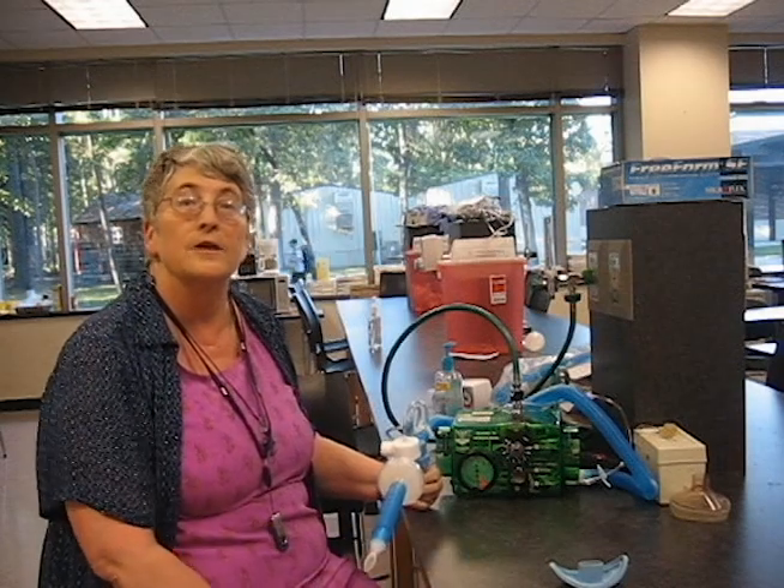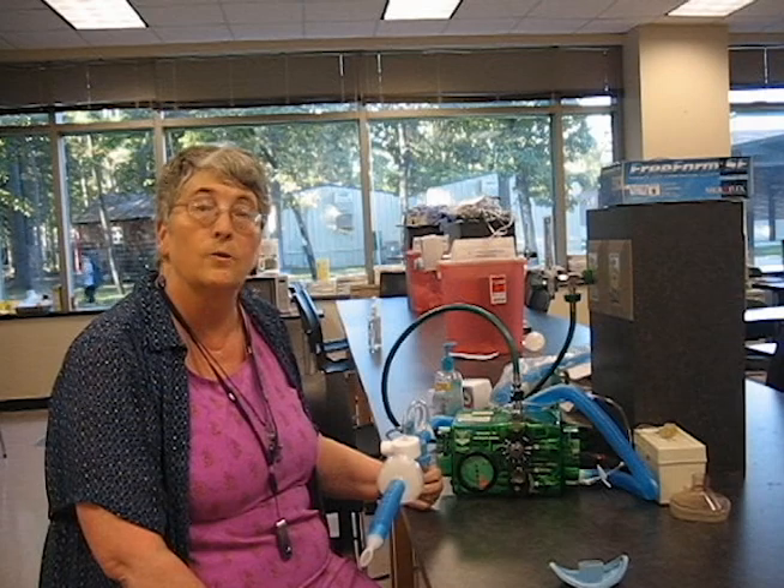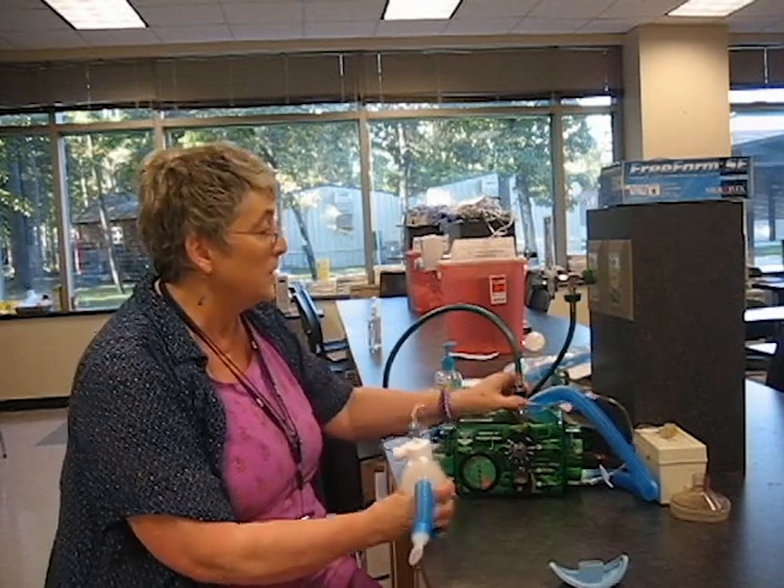Hi, I'm Kelly Busby with Kingwood College, and we're talking about IPPB. The earlier film talked about how to give a treatment correctly. I'm going to show you what the patient can do to make the treatment incorrect.